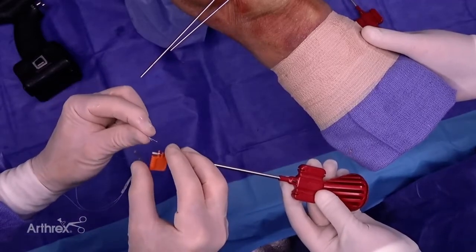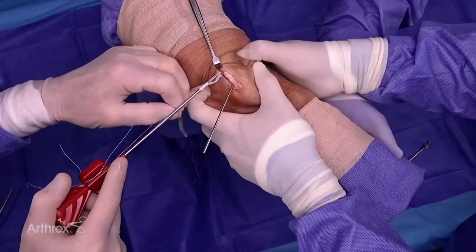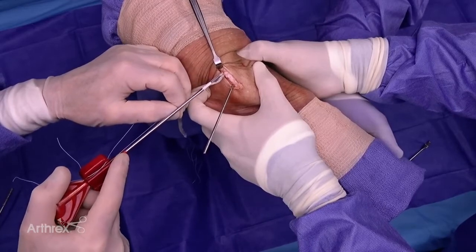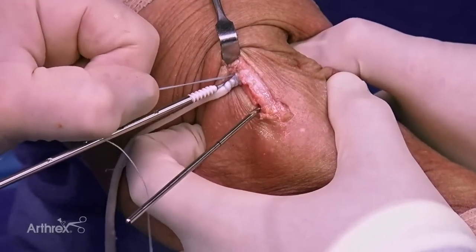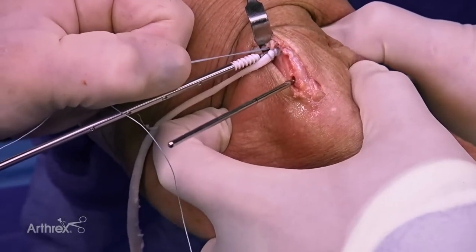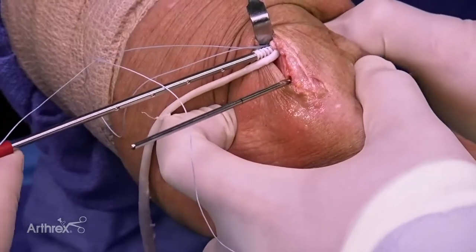We're going to pass our sutures from our graft. This is from a 2-0 FiberLoop. Now we're going to insert our graft — the sutured end from a 2-0 FiberLoop — with the 3.9 SwiveLock in our proximal hole. I like to hold these 2-0 FiberLoop sutures to make sure that the suture part of the graft goes into the hole with the tip of the fixation device.